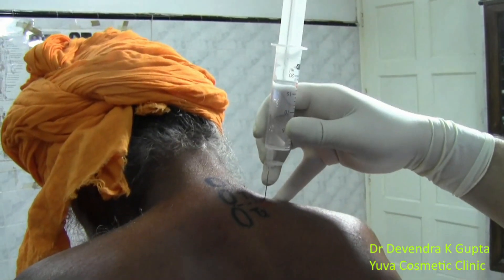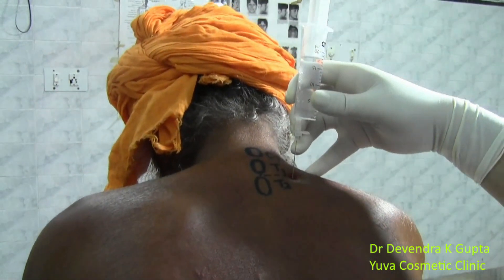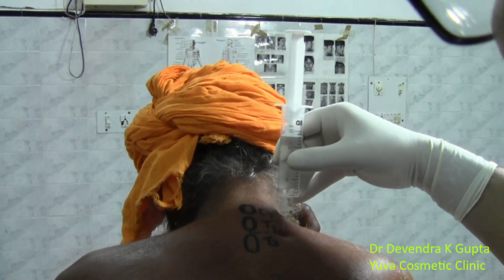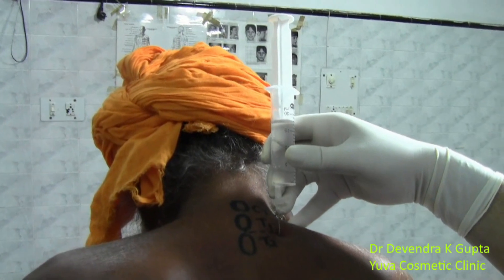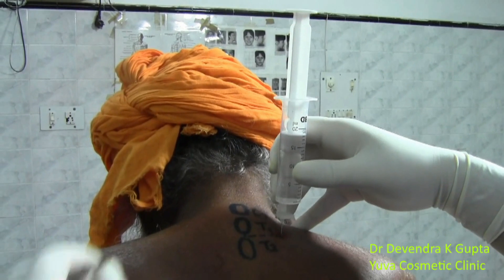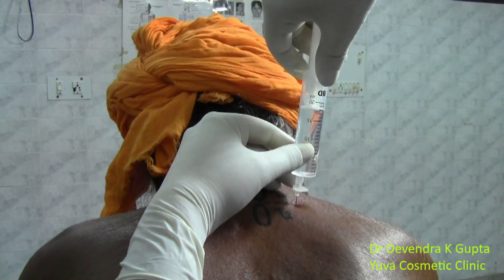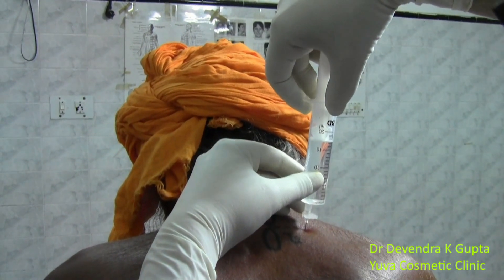Withdraw the needle towards the skin and then redirect caudally. Now again strike the bone, then further withdraw the needle and redirect further. Now it is going through. At this level, always aspirate and try to inject — you will have a give-point feeling.